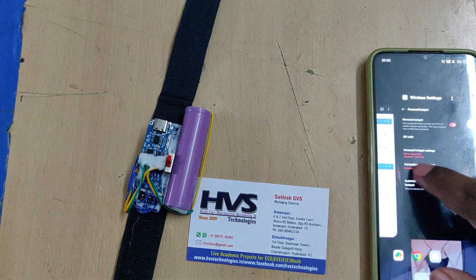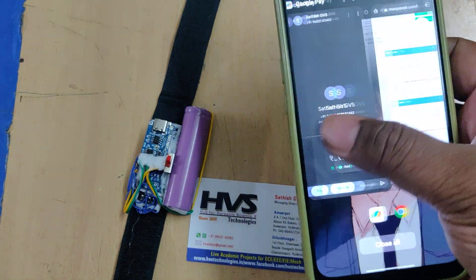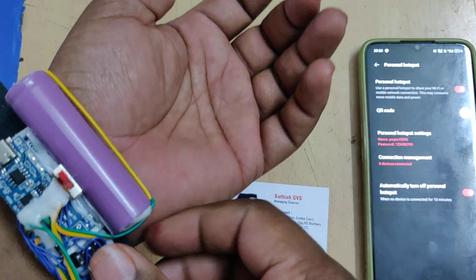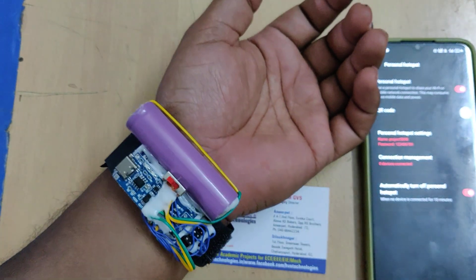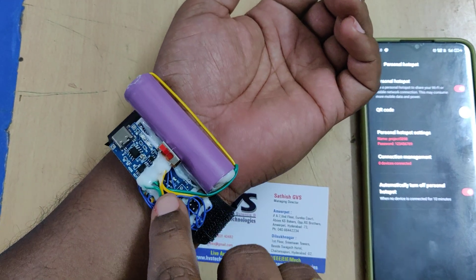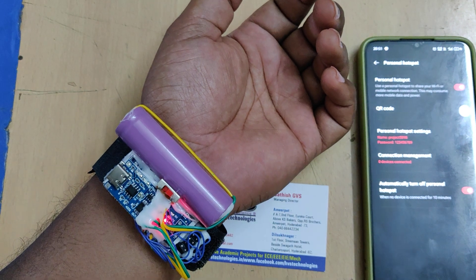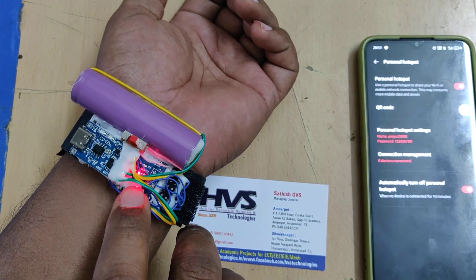Then log in to the ThingSpeak cloud platform and stay on the hotspot settings screen. There you should see one device connected. Mount the device on your wrist as shown in the video. If valid heart rate and SPO2 data are achieved, there will be LED indications — one LED is the power indicator, one blinking LED shows the data reading status, and another LED shows the status of valid data. There is also an on/off switch.